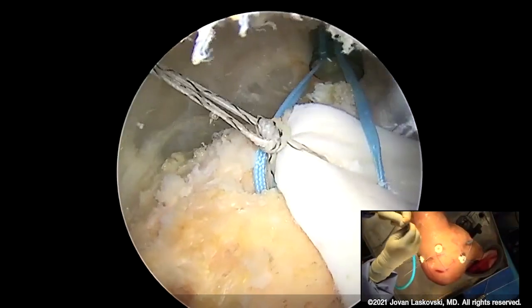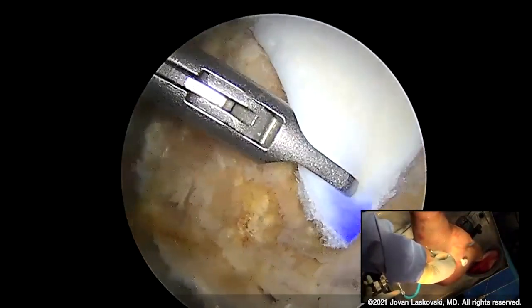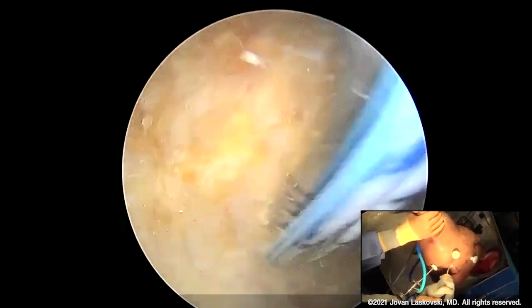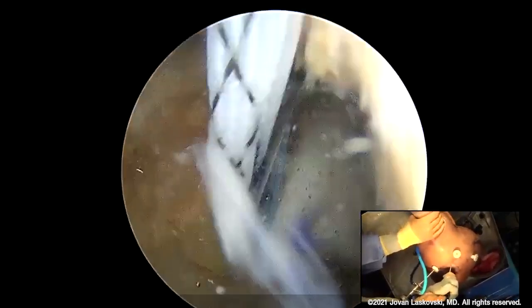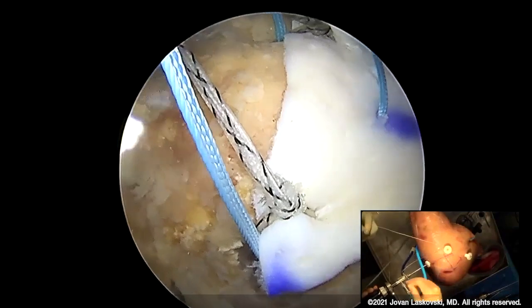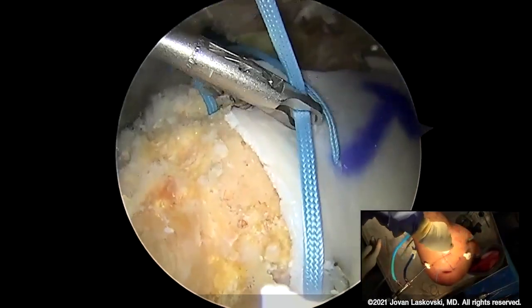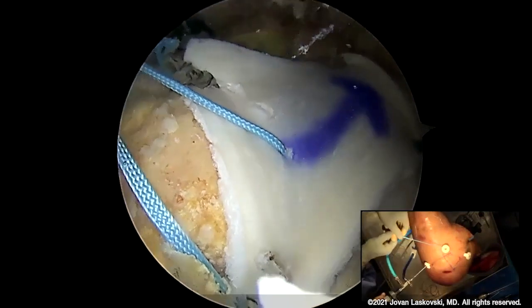We'll tie this down and then get our in-situ tensioning. That looks to be about the spot. I'm checking my tension — I think we're going to be in good shape. I really like the self-cinching nature of the Y-not-RC; it makes for a smoother transition in the operation. This is an operation where you do not want to rush. This is likely the patient's last opportunity at a good outcome with a deficient cuff, short of an arthroplasty. The worst outcome would be a floppy, incompetent graft. With this technique and dynamic in-situ tensioning, you'll always have a graft that's tensioned appropriately.